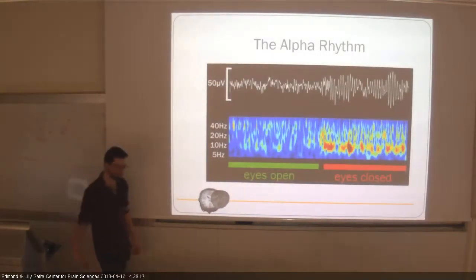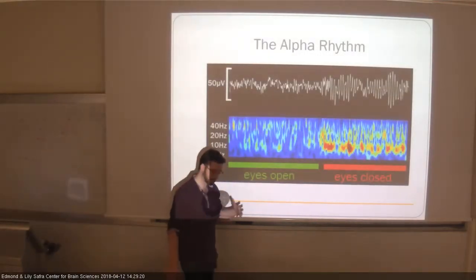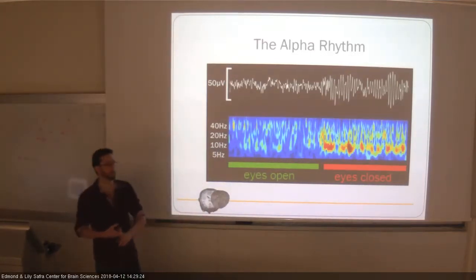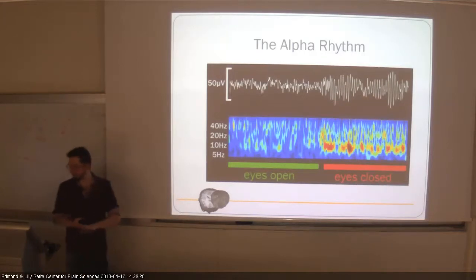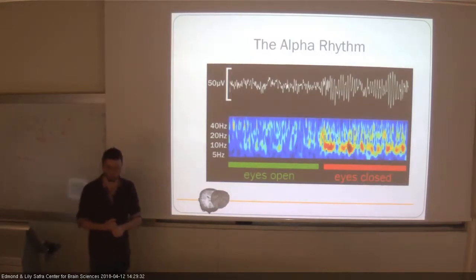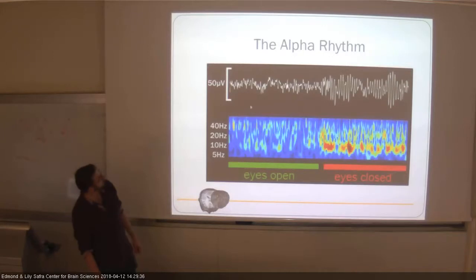and this is something that Hans Berger already noticed in 1929, when he invented the EEG. It's really affected by closing your eyes. Whenever you close your eyes, there's a really strong increase of these alpha oscillations, these 10 hertz oscillations. So this is the time representation. Here we can see a time frequency representation.